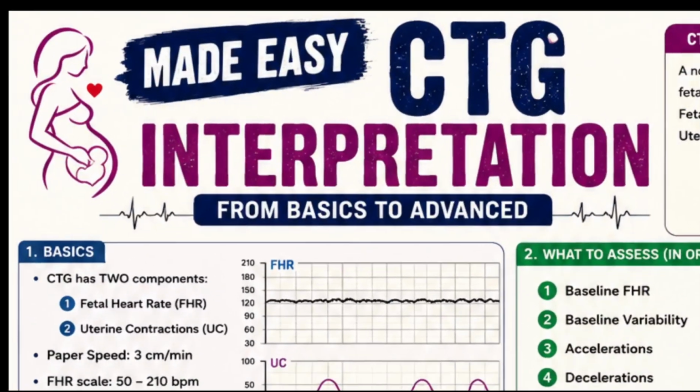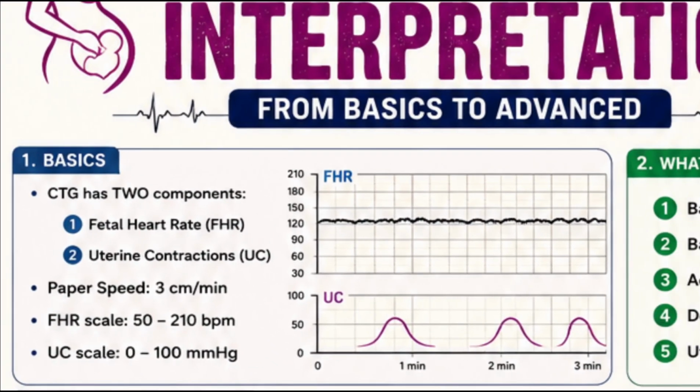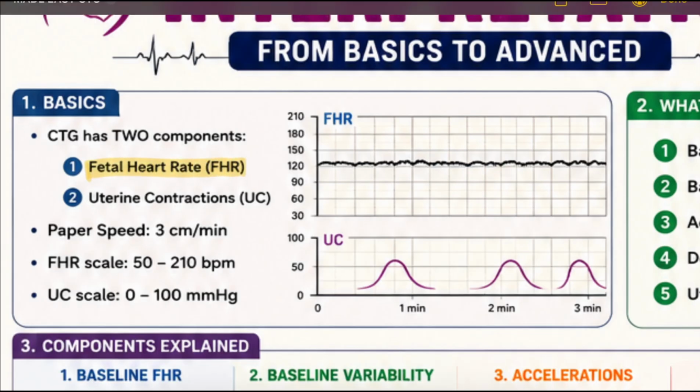First of all, we will learn from the little basics, then go forward. So what is CTG? CTG stands for cardiotocography. It continuously records fetal heart rate and uterine contractions.